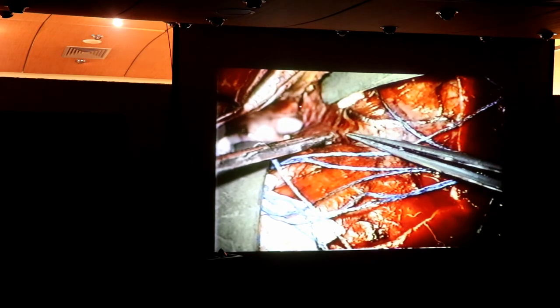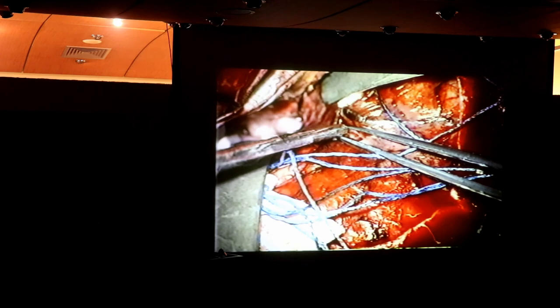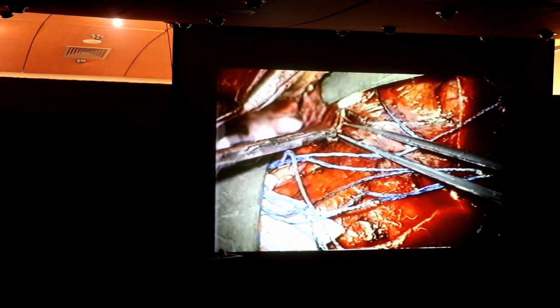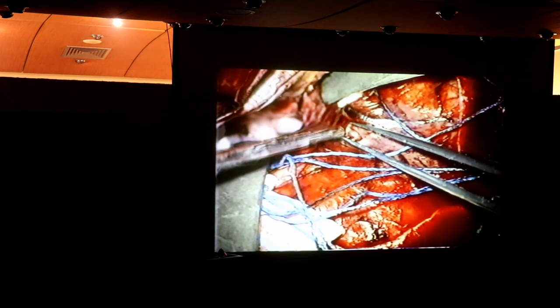But patiently, you would drain CSF, etc., and then you start seeing the optic nerve, and then you see the carotid. You try to make sure that the carotid is available for you to put a temporary clip on it if necessary. Now, the carotid is ready for me, there, optic nerve, carotid. Now I'm opening the Sylvian fissure. This is the way to open it.